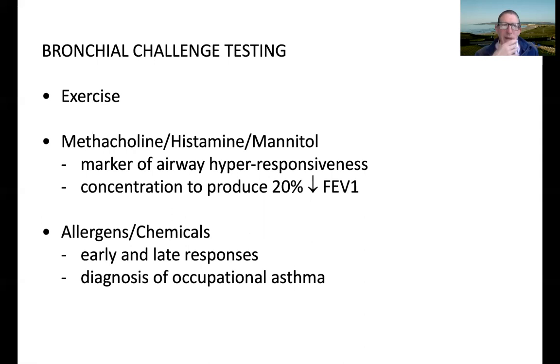So next bits are for information, really. You don't need to know about them, just need to know they exist, but you won't be examined on it. We can do bronchial challenge testing to induce bronchoconstriction. The way we can do that is exercise, or we can give a chemical like methacholine, histamine, mannitol. And that's the way in the clinic that we assess airway hyper-responsiveness. So we'll come to that. Or you can use an allergen or a chemical, particularly allergen.